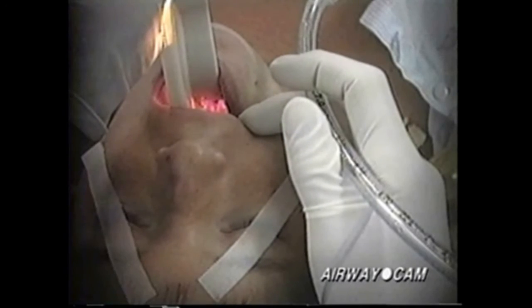The laryngeal view in this patient does not include the white of the vocal cords, but the posterior cartilages and interarytenoid notch are well seen. The small dark hole above these structures is the glottic opening.